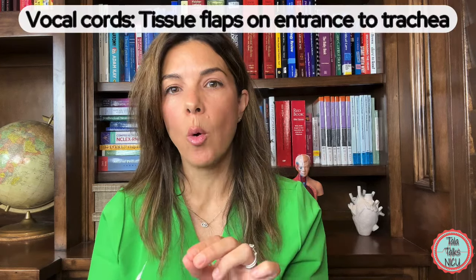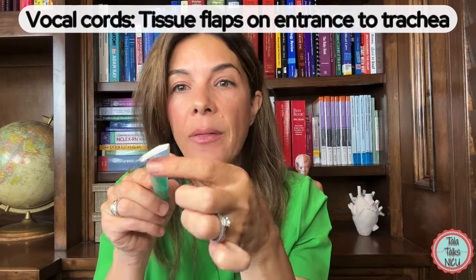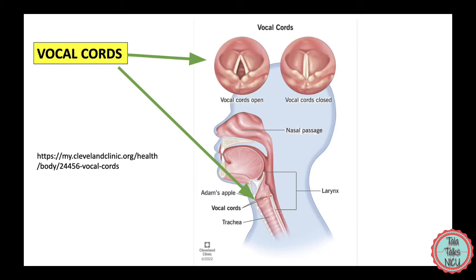A couple more anatomical things you need to understand. The vocal cords are like flaps of curtains at the top of the trachea. On either side of the trachea, there are vocal cords which kind of open and close to speak or to protect the airway. You have to be able to pass the endotracheal tube through those vocal cords.